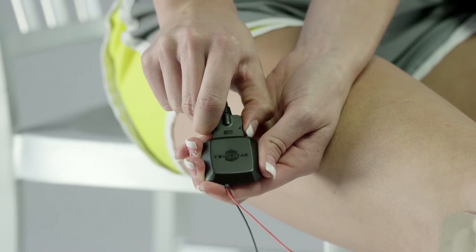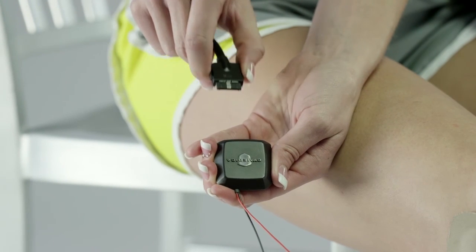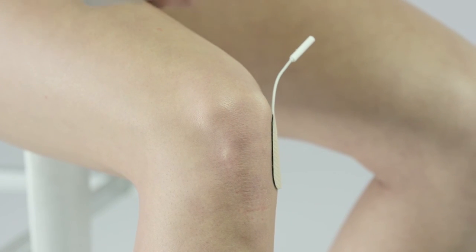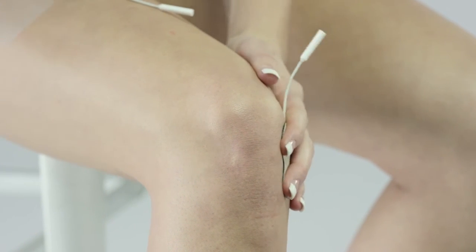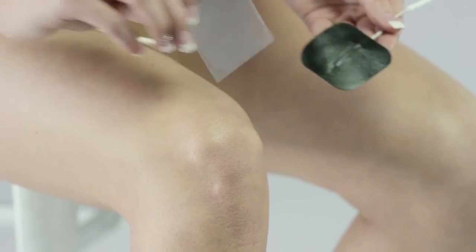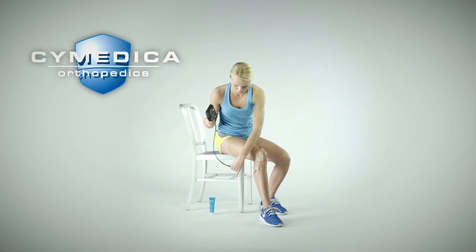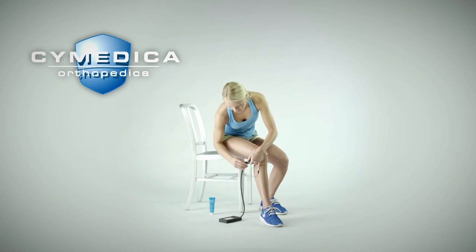Disconnect the user interface cable from the TENS pod by squeezing both sides of the cable connector and pulling away. Make sure to reattach the electrode covers to the electrodes after the treatment is complete to keep the electrode hydrogel surface hydrated and tacky. The electrode should last for many uses before they become dried out and need to be replaced.